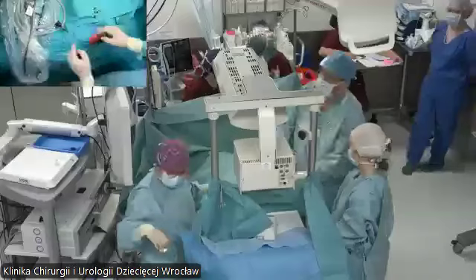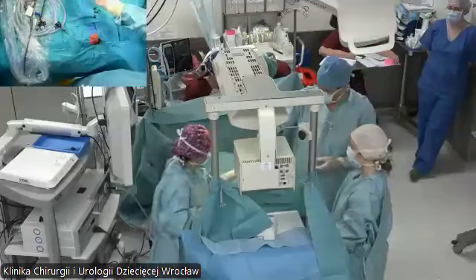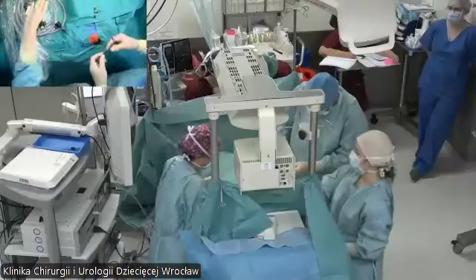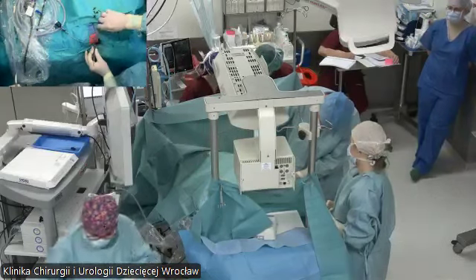So as you can see, right now we put a drain into the chest and we will ask our anesthesiologist to expand the lungs. And with the final stitch, we'll take the drain out. Is that okay? Yes, there is a question from the audience.